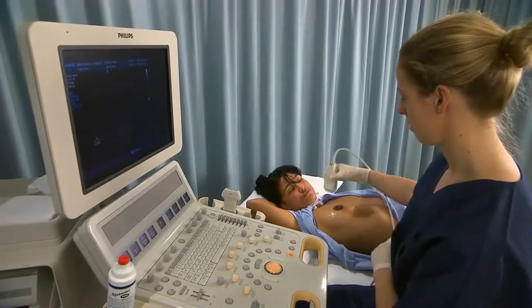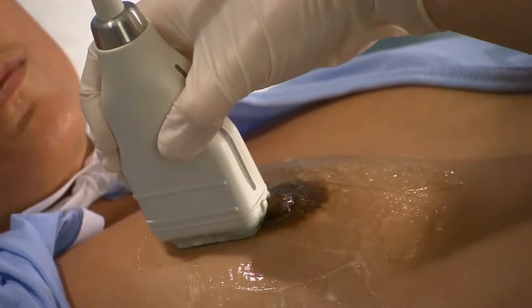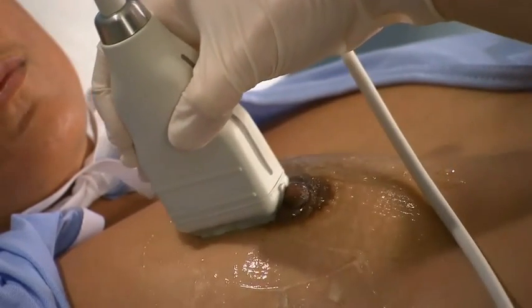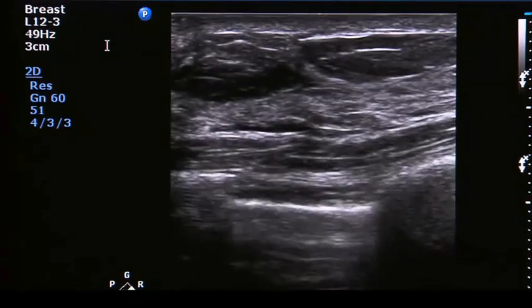To scan the breast with the clock method, place the transducer in the radial plane at the 12 o'clock position. Ensure that the notch of the transducer is facing the nipple. Manipulate the transducer until a suitable image of the breast is obtained.